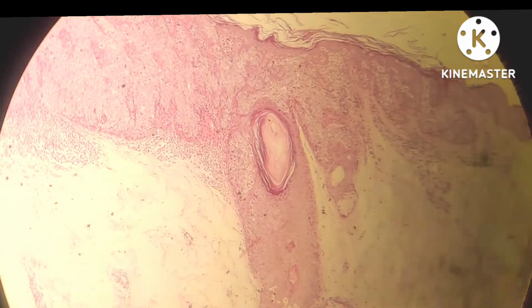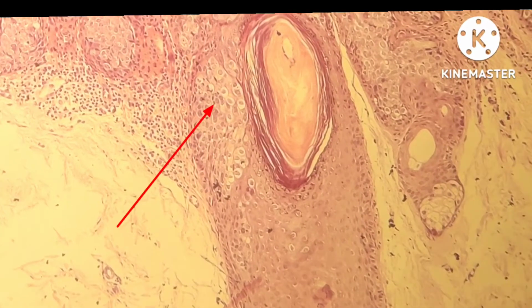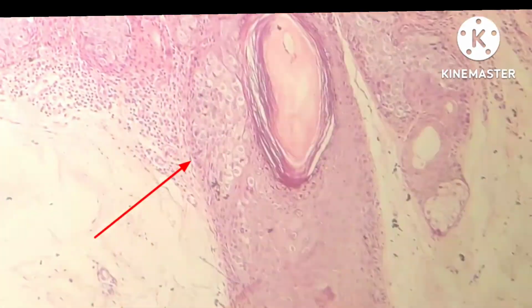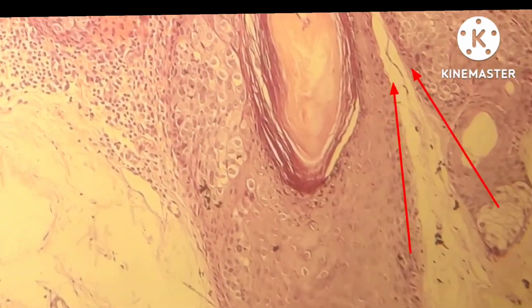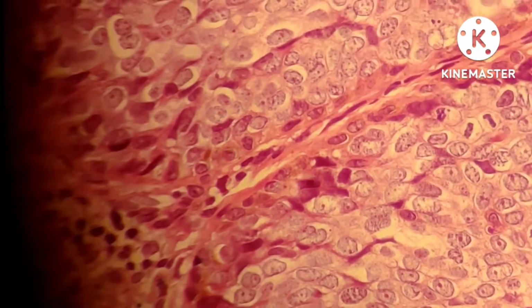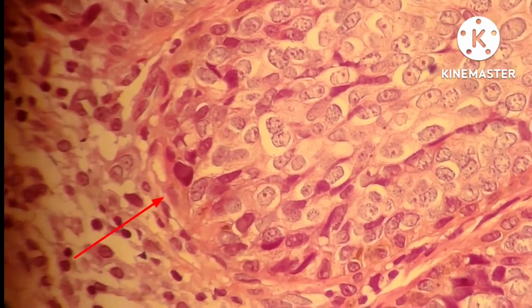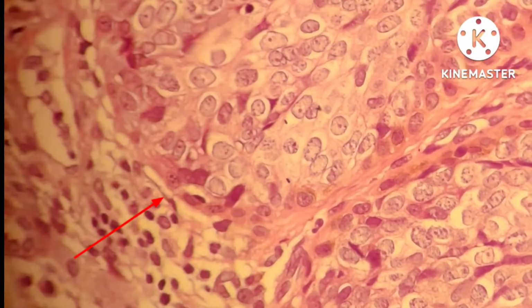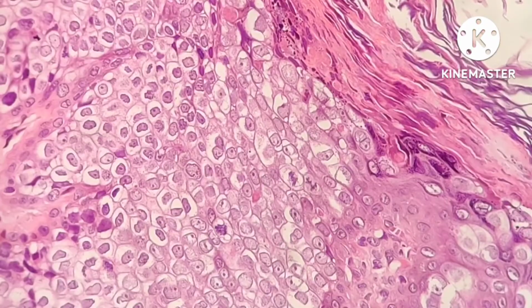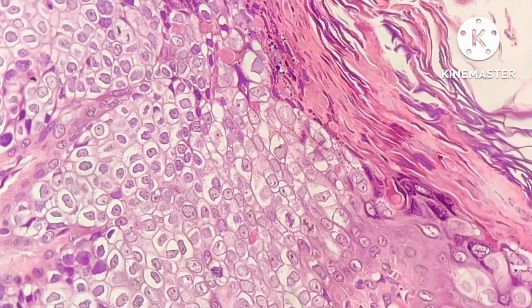The infiltrate of atypical cells in Bowen's disease frequently extends into follicular infundibula and causes replacement of follicular epithelium by atypical cells down to the entrance of the sebaceous duct. Even though the marked atypicality of the epidermal cells includes the cells of the basal layer, the border between the epidermis and dermis everywhere appears sharp and the basement membrane remains intact. A finding in Bowen's disease is vacuolization of the cells, especially in the upper portion of the epidermis.